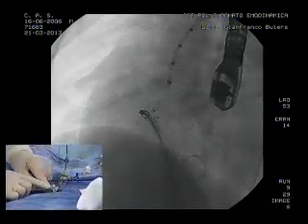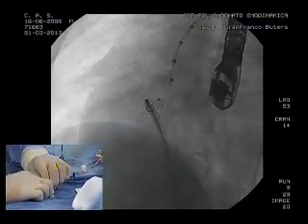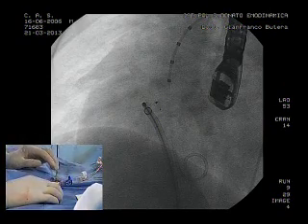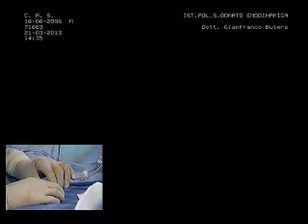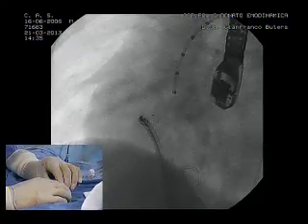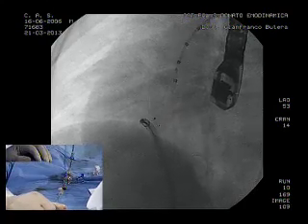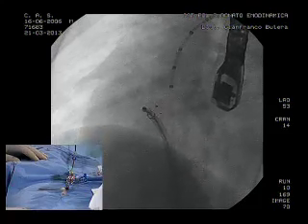Yes. So this is the pin vise. I'm going to open this here. I'm going to bring it back here. I'm going to open this guy here, and I'm going to fix the cable. It's okay. And bring the capsule. Looks like it's sitting great. Okay, so it came back. You see it there? That's good. So now we are ready to release the device.